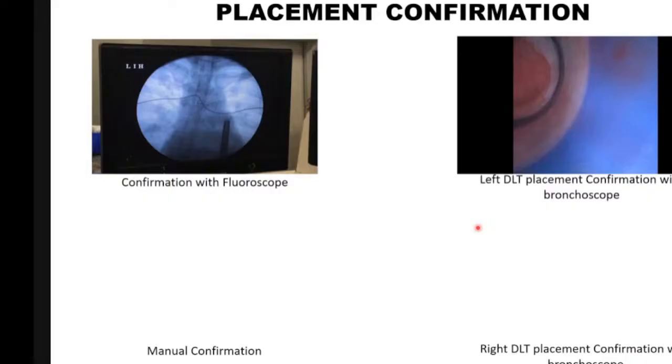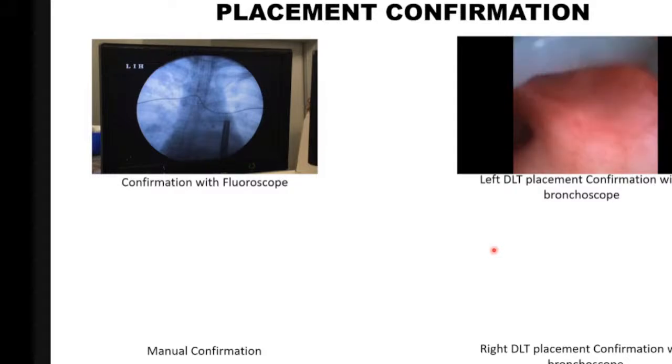Tube position inside the bronchus, but we will try the upper lingular, and if we succeed, then we try to go in the lower. But altogether on the left side, we can see there are 2 apertures separated by the left carina. So that is the left-sided left main bronchus, as well as the position of the tube. Going to the right DLT, the same method.